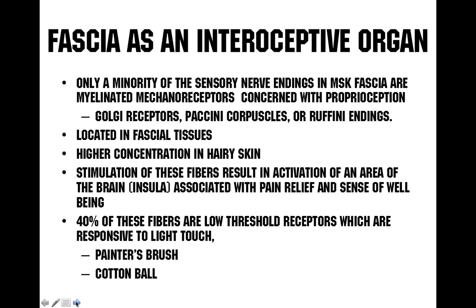Taking a bunch of tools and rolling them out in front of your patient and scaring them may not be the best tactic to get the outcome you want. What I do with tools is I take a tool, the RockBlades tool, and I let the patient hold it. I let them touch it, become aware of it, check the edges, and then I communicate that I'm going to mitigate or downregulate your pain through this type of stroke, and I'll show it on their hand or their palm so they relax.